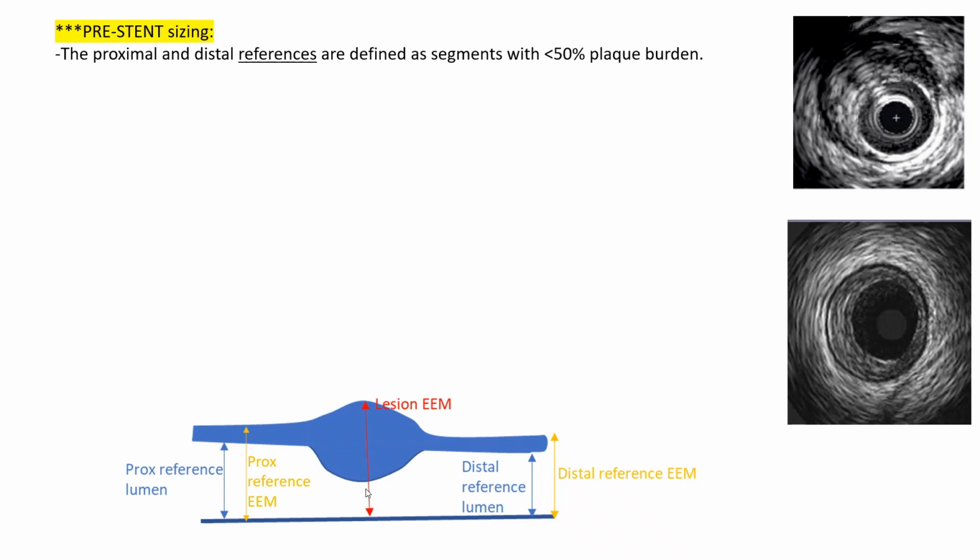We define stenosis severity lumen to lumen, and it is severe if the diameter stenosis is over 70 to 80%, which corresponds to a plaque burden area at the lesion site way more than 70%. It's just that when you have decided to stent a stenosis, it is preferred that you land it in a healthy area with a plaque burden less than 50%. This will help improve the stent flow and the long-term stent patency, especially edge restenosis.